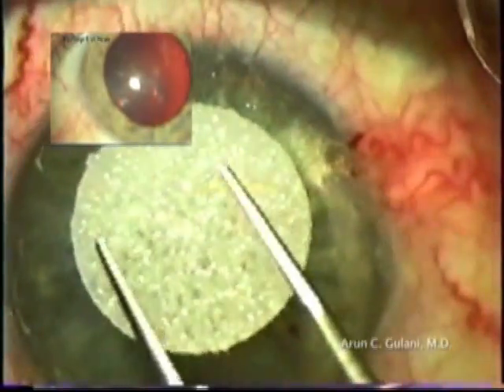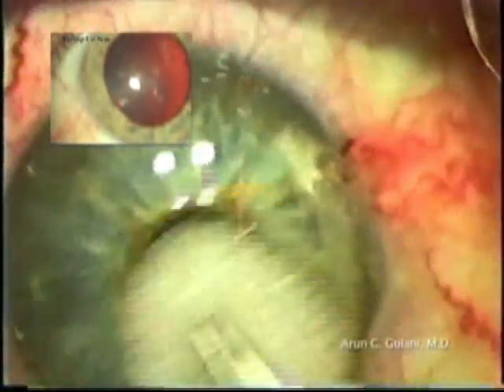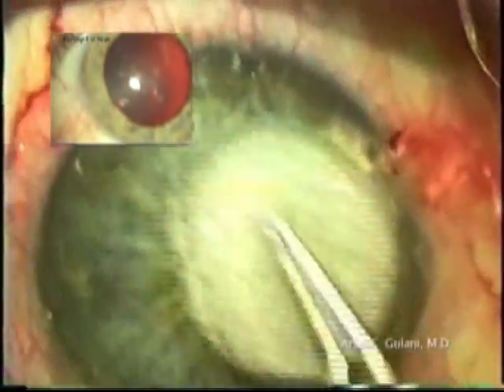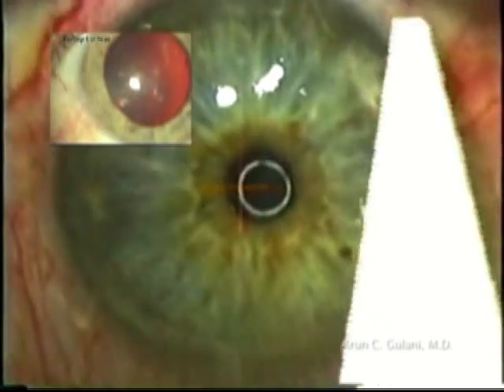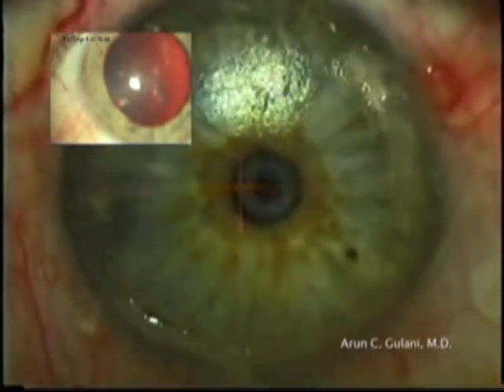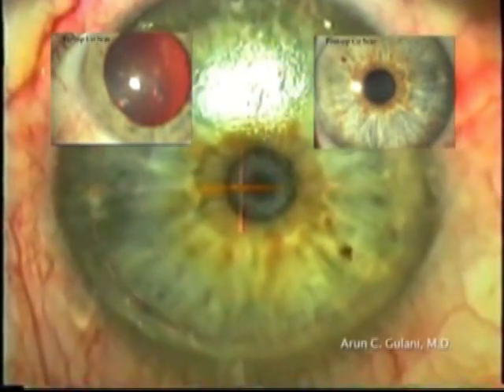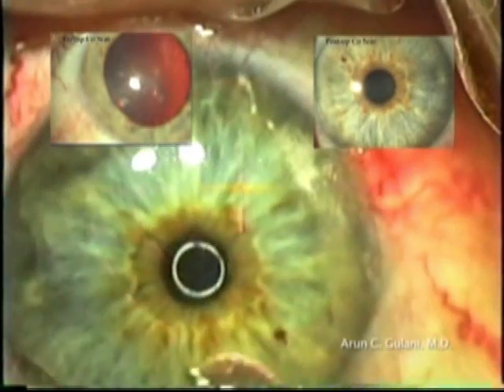Mitomycin C application is then performed, achieving complete central clarity to an excellent outcome.